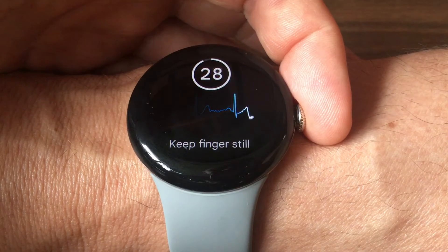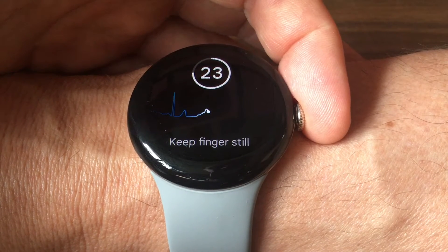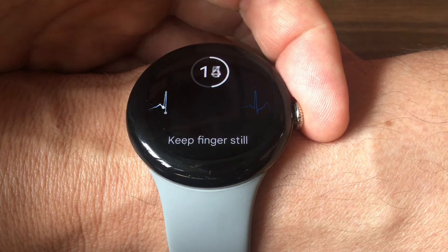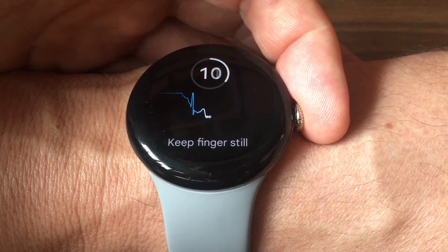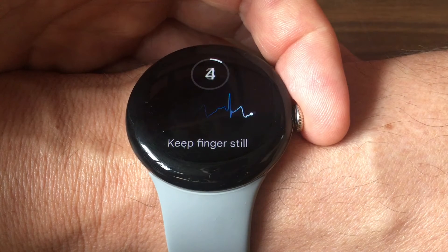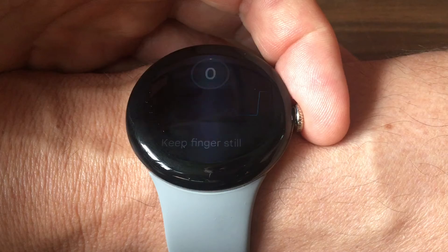Basically, you need to place your finger on the crown and rest it there, remaining perfectly still for 30 seconds while the watch takes your measurement. Upon completion, you'll be given one of three results: normal sinus rhythm, atrial fibrillation, or inconclusive. If you get the last one, you'll need to retake your ECG — it does happen, and it all depends on the positioning of your finger.